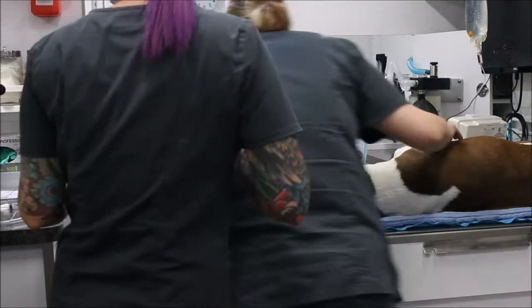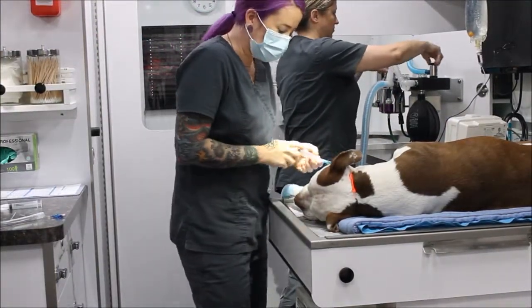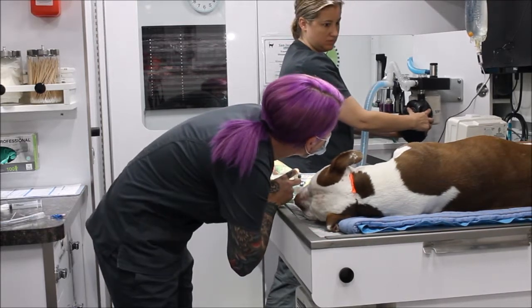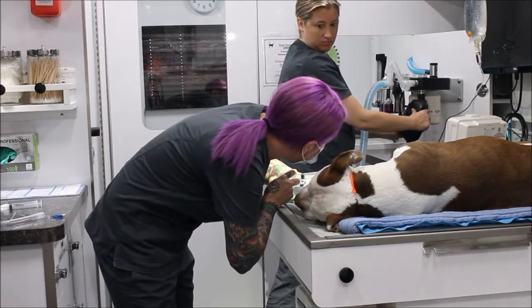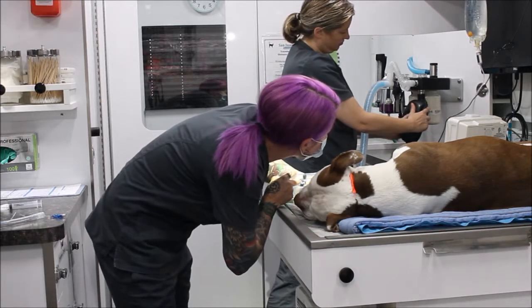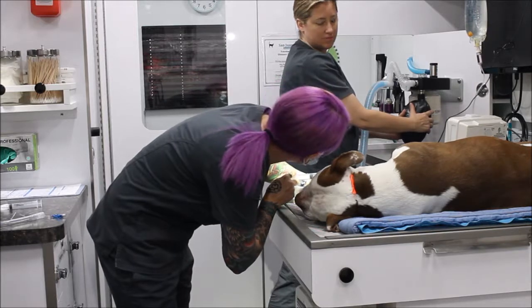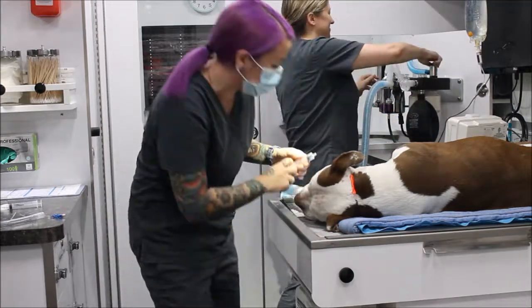Now we're going to inflate the cuff. My doctor is going to push the bag and I'm going to slowly inflate as she pushes to about 20 centimeters of water, listening for any leaks. We should hear a small leak when she goes over 20 centimeters of water. Inflating as needed — and I'm good, I don't hear any leaks.